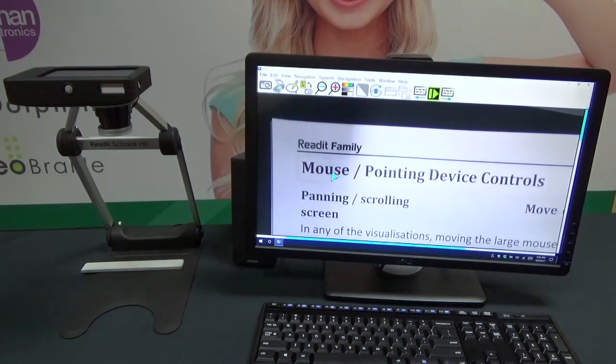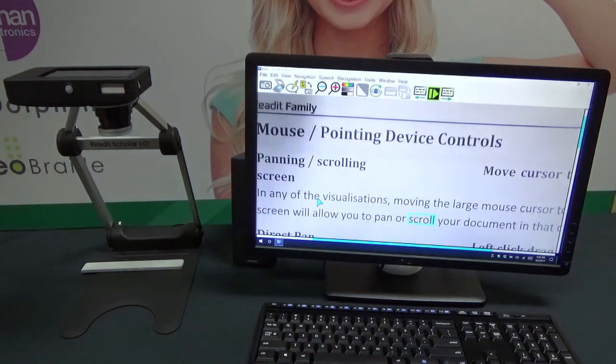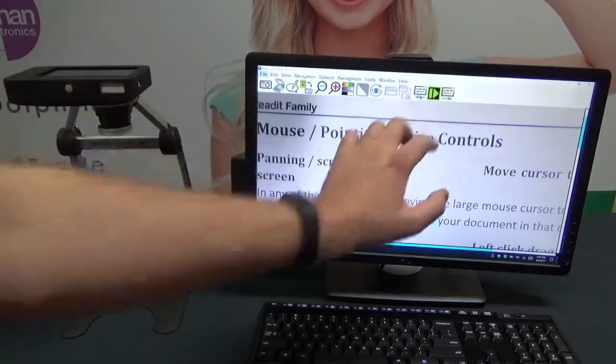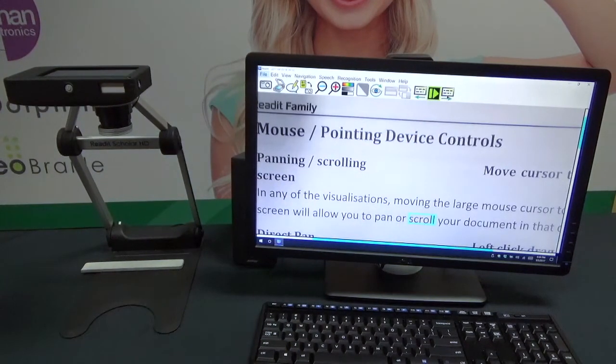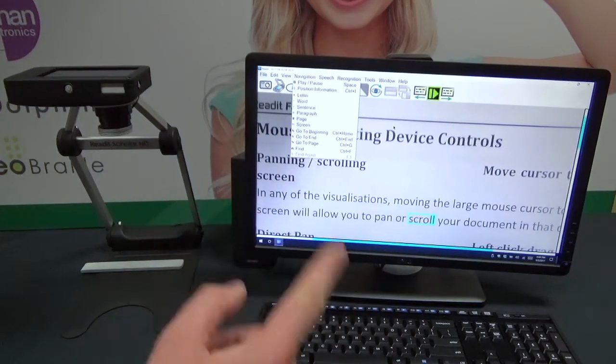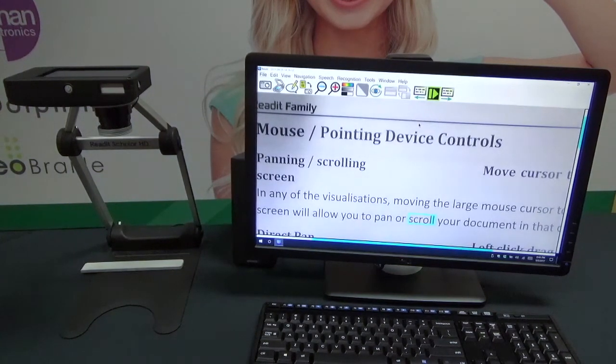I can use my mouse to scroll to an area that I want to read. There are also navigation buttons for navigating between screens if you have multiple documents open, or it jumps between paragraphs. You can go up to Navigation and it gives you keyboard shortcuts for navigating by letter, word, sentence, paragraph, page, or screen — go to beginning of document, end of document, or go to a particular page. You can do multi-page captures with this and capture an entire book at one time if you wanted to, or a large multi-page document.